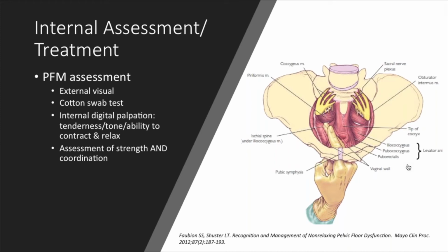So with real-time ultrasound, we're able to see the activation, we're able to see the lift of the bladder and the timing with the TA. We're also able to see the integration with the diaphragm. And as Megan mentioned as well, we're able to do a nice functional neuroeducation progression, integrating alignment and movement integration.